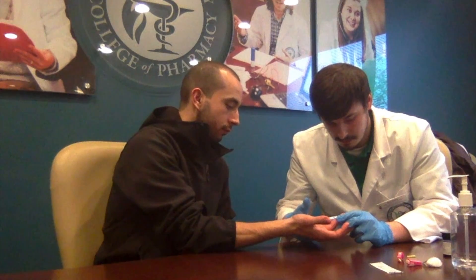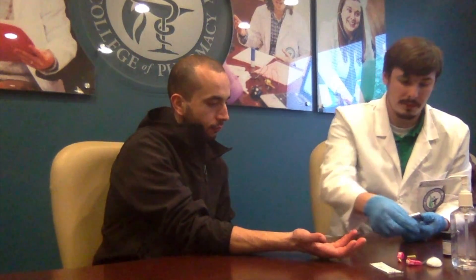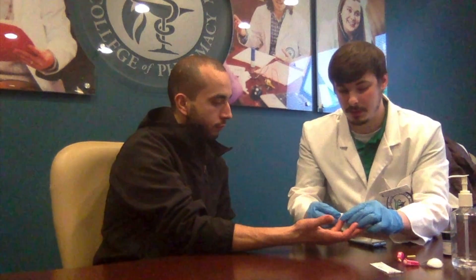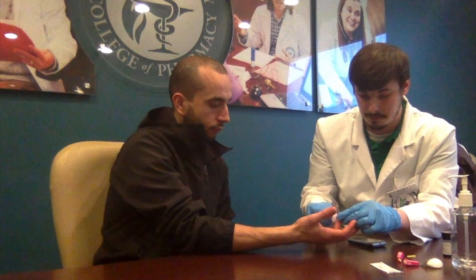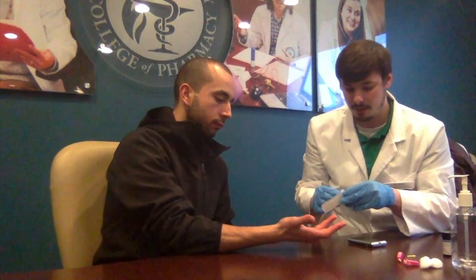Your blood glucose rating is 115 milligrams per deciliter. So 115 is your reading. If you recall, I had said that what you really want to get is anywhere between 80 and 120 — so you're at 115, which means you're within the range and your blood glucose level is normal. Go ahead and use a cotton ball to clean up and a Band-Aid.